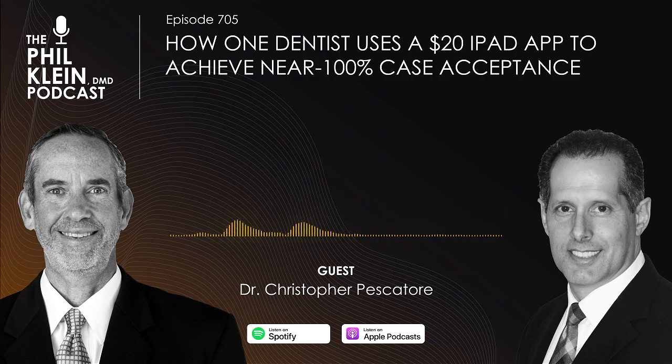Well, wax ups have changed. With the digital environment, your diagnostic wax up you get from a lab, to me, is not the same as we used to get before digital. Before, we used to get wax ups that were usually made with the lost wax technique, where you basically take that part of the tooth away and you just don't grind the teeth down and give someone a complete wax up. Because when you do that, there's a lot of extra material and bulk and occlusal adjustments.